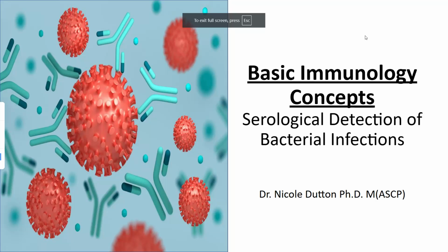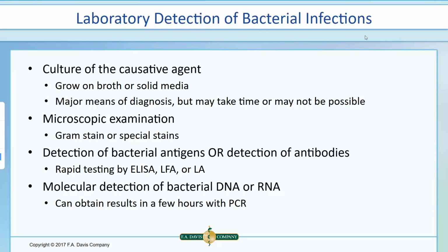Serological detection of bacterial infections. So for laboratory detection of bacterial infections, there's a couple different things that we do. We would culture the causative agent. We would do a microscopic examination, like gram stains or special stains.